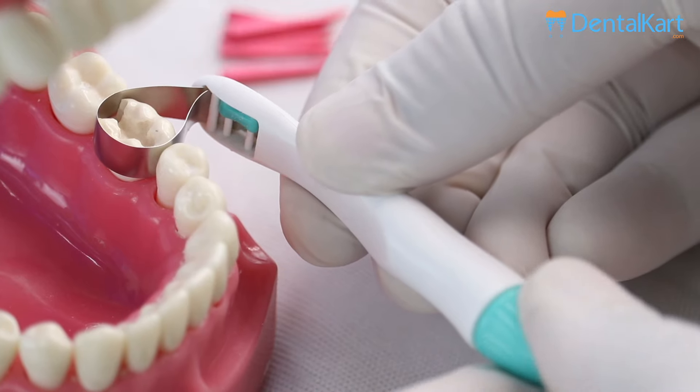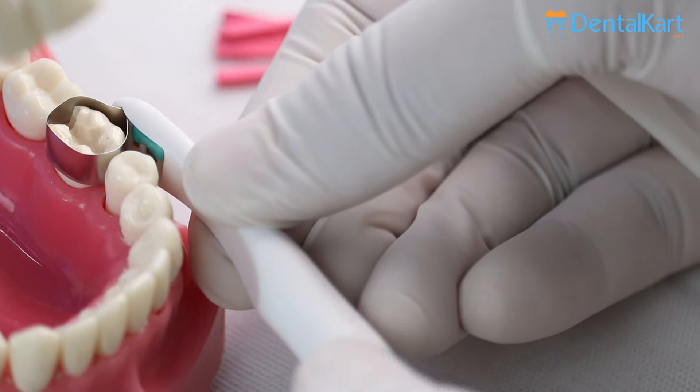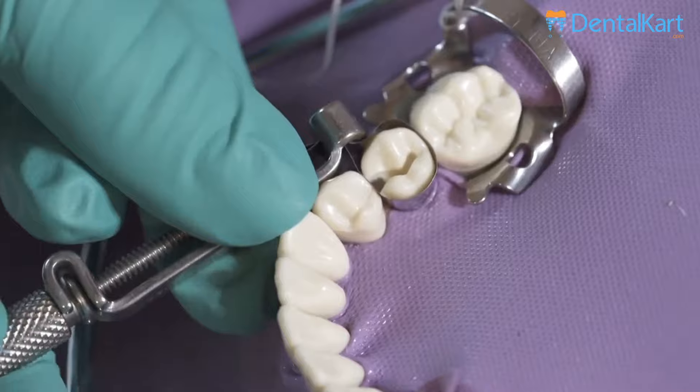As we have seen, Superindo Automatic Matrices can be placed around the tooth so effortlessly in comparison to the conventional matrix band and retainers.